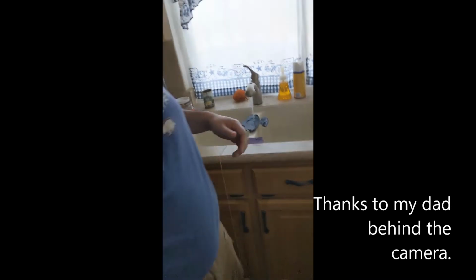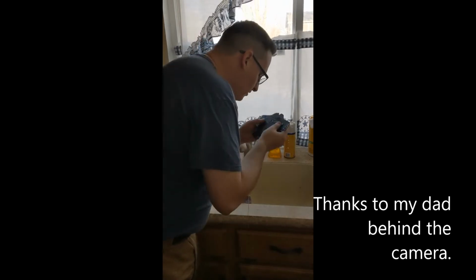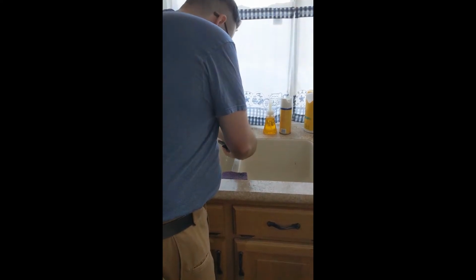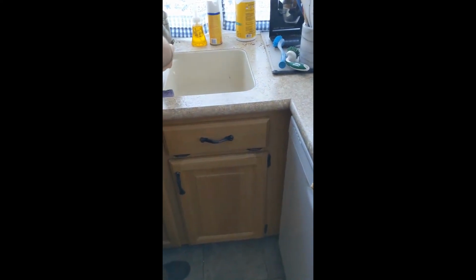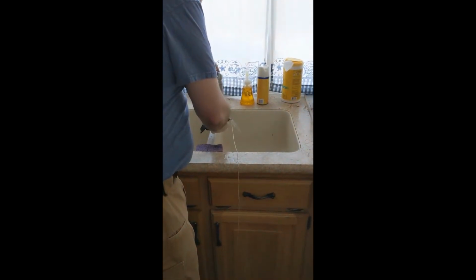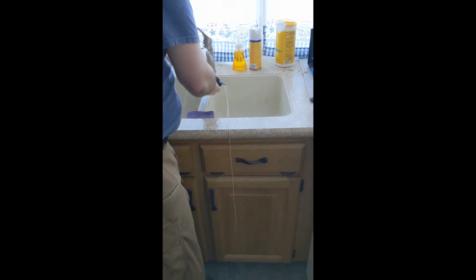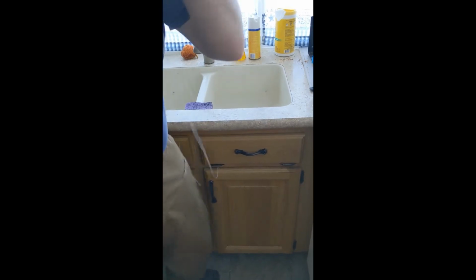Right there. And just hold it. Trying to get the nose form. I can't get the nose form up real well.